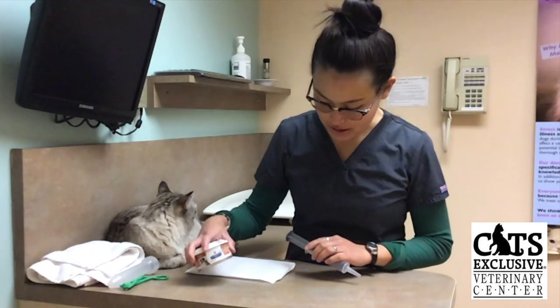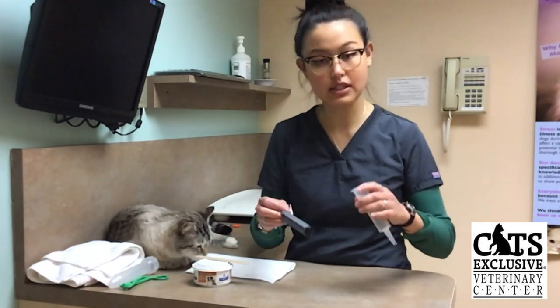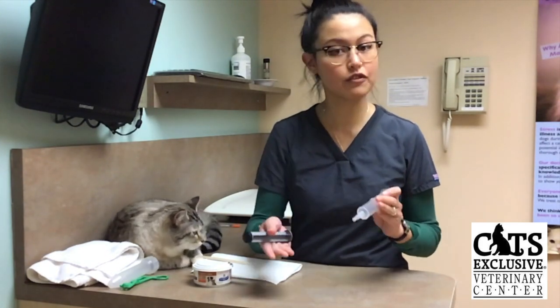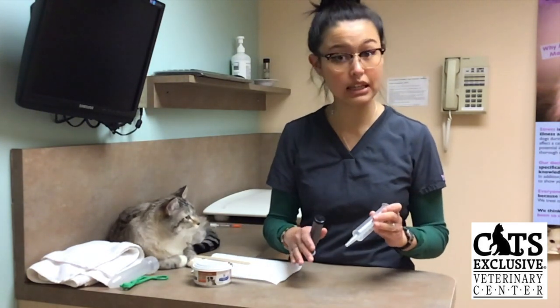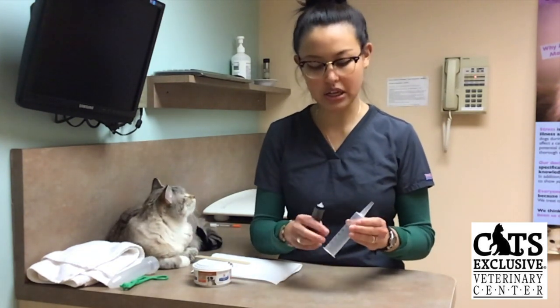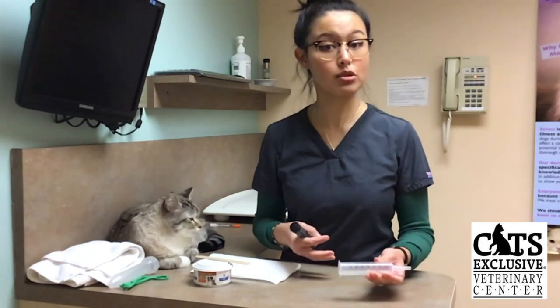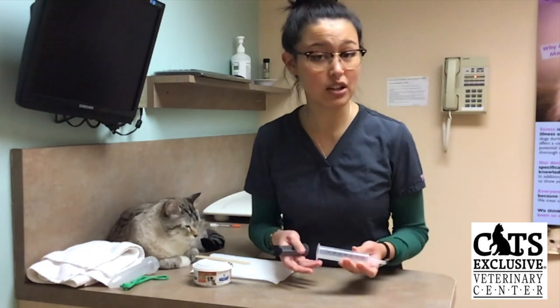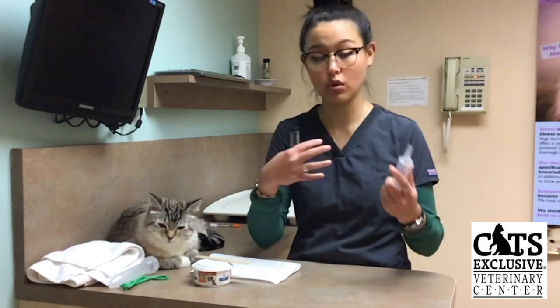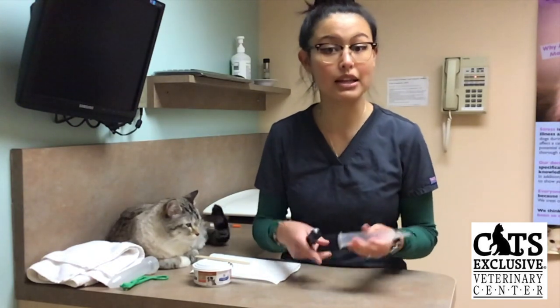We typically recommend syringe feeding with a food called AD. The reason we like it is because it's very smooth, so it goes into the syringe very well and feeds out of the syringe very easily, and it tends to be pretty high calorie. So even if your cat's not eating a ton in terms of volume, they're still getting a good amount of calories, and they tend to find it pretty tasty. So even though you are syringe feeding them, if it tastes good, they don't tend to mind it as much.